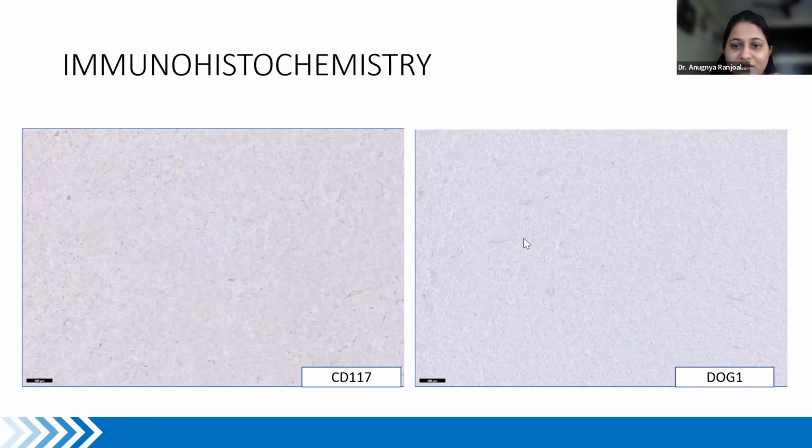These are very good differential diagnoses, and definitely because of the sclerosing stroma, it was very clear that you come down to a specific few diagnoses. I'm really happy that few people could actually think about it. So CD117 was negative, and DOG1 again, both were negative.